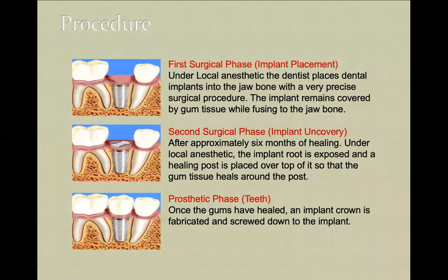I'm talking about a standard surgical case. Once you place a dental implant, it requires some time to integrate with the bone. And we have some standards. For the mandible, this is 3 months. For the maxilla, this is 6 months. That's it. No questions, no discussions.